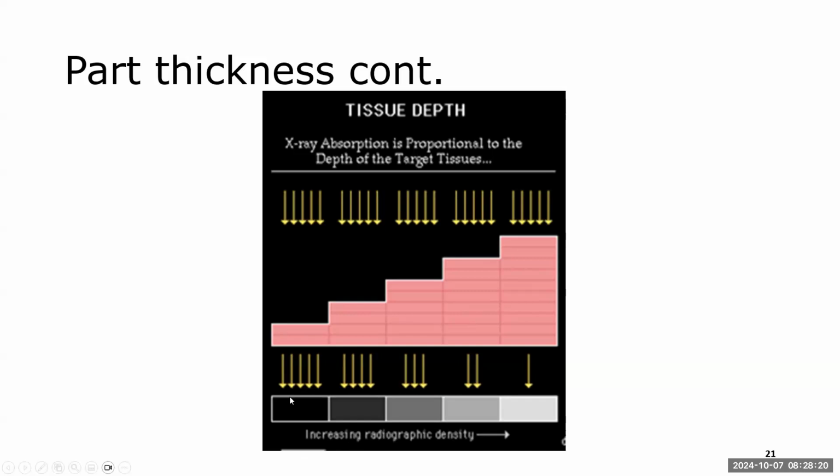But you can see that the number of photons that make it to the IR and represent a brightness level changes, right? As the number of photons that reach it changes. So very dark areas of the image mean what? Did more or less radiation make it to those areas? More, right? That's something you're going to need to understand for the test that you're getting ready to take this week. Receptor exposure: blacker areas of the image mean more receptor exposure was incident upon that area.